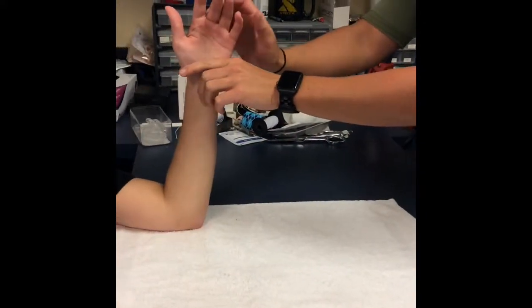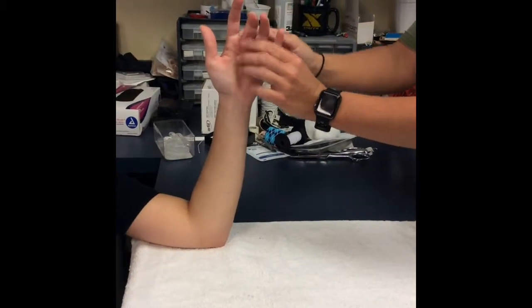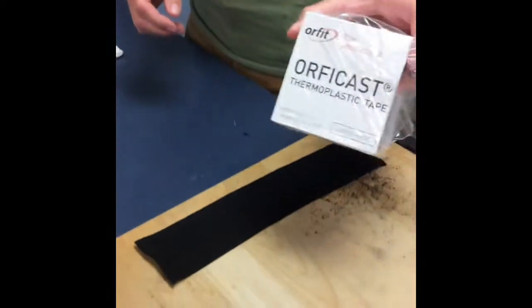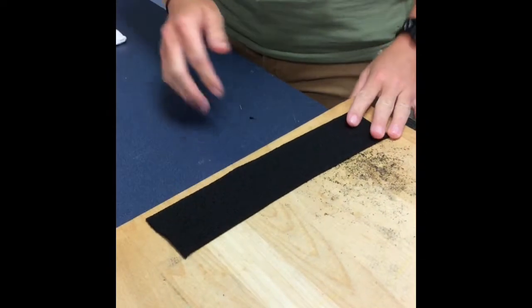This orthosis is called a relative motion orthosis, and it's to improve PIP flexion. It's for finger stiffness. First, you want to get your Orficast and make it about three lengths of the patient's MCPs.